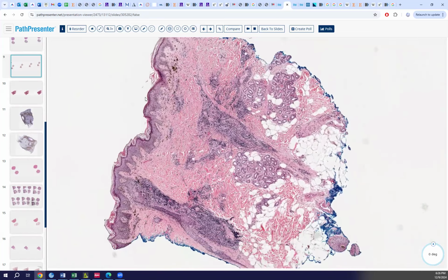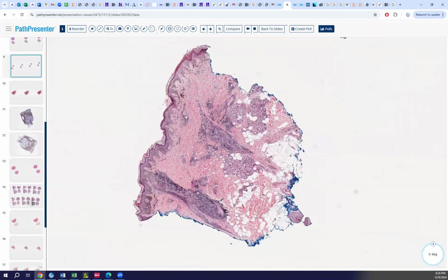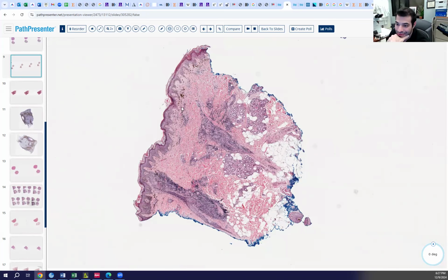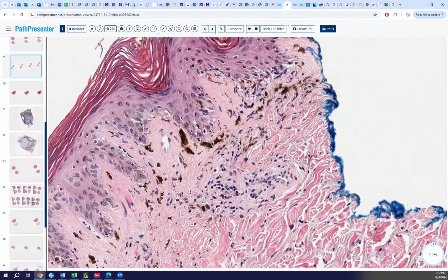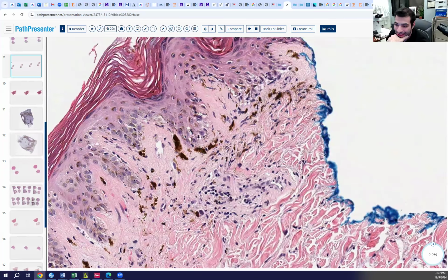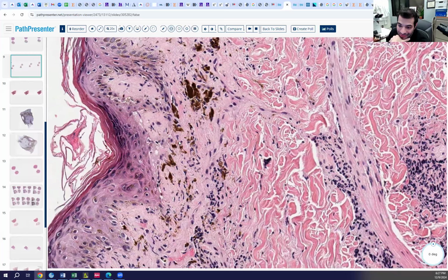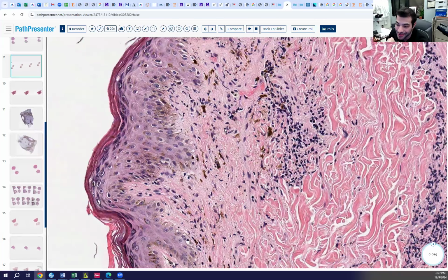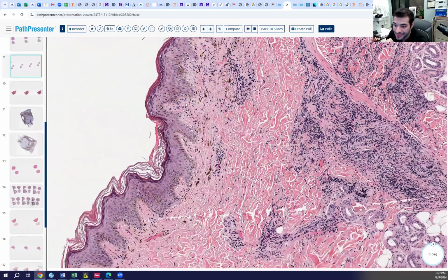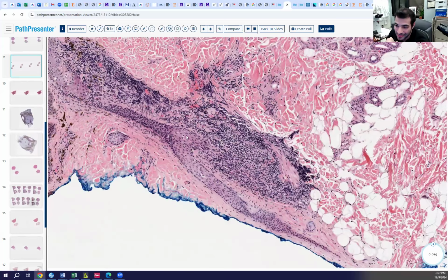Inflammation for days. Okay, let's classify. Where is the inflammation? It's pretty high up, but it also involves the entirety of the hair shaft. Okay, so there's superficial. Oh, some pigment dropout. There's pigment dropout, some vacuolation of the DEJ. It might be burning out, but there are some subtle interface changes here, or maybe some burnt out interface changes. And then this, so superficially perifollicular.